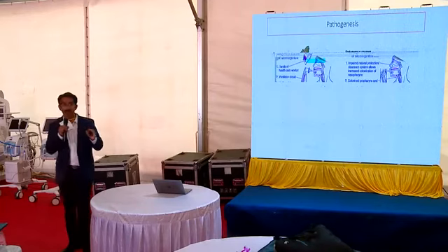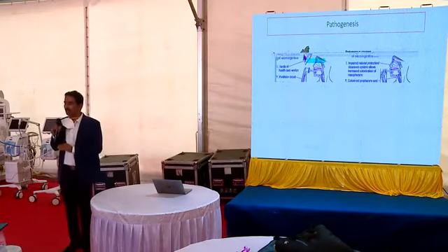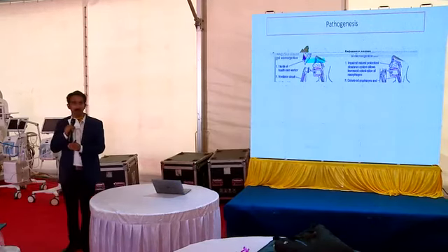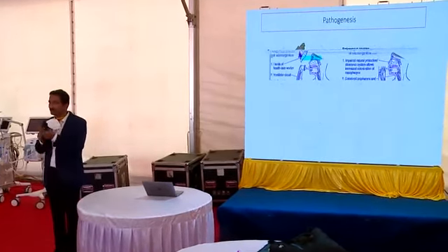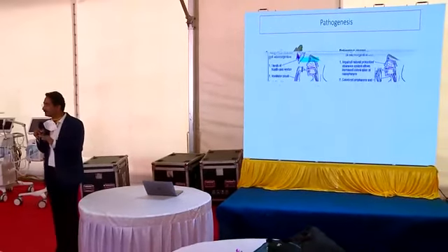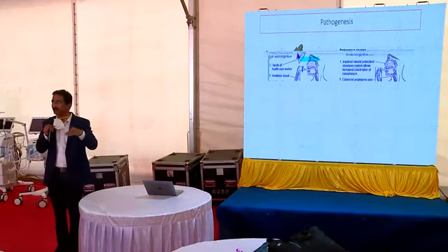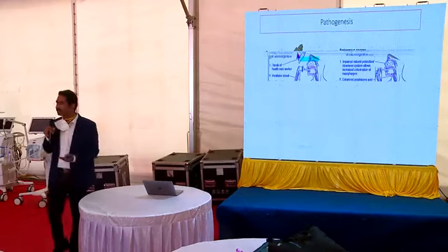We have to make sure that sterile water is put in the humidifier and not non-sterile water. And the process of putting water into the humidifier is also important. You would have seen nurses puncturing the bottle many times, which often keeps leaking. The preferred route is to have a closed system. So most of these humidifiers have an automatic system where it fills when the water level comes down, and then it closes on its own.